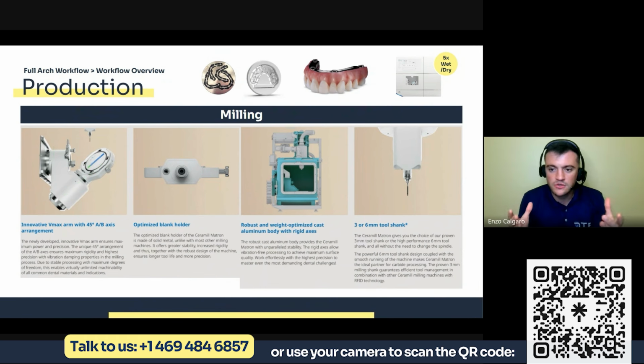The main thing you have to control when milling is vibration. So when you have this arm here, you're going to control a lot of the vibration. You reduce a lot of that. It is the only mill in the market with that kind of technology.